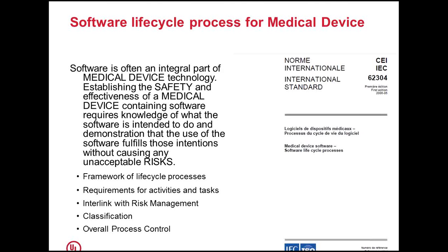So safety and effective functioning of the medical device needs to be looked at from the process point of view: how it has been developed, how it has been controlled, how it has been released, and how the feedback mechanism works to maintain the software effectively. There is one IEC international standard called IEC 62304, which defines the software lifecycle process for medical devices.